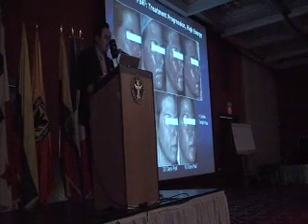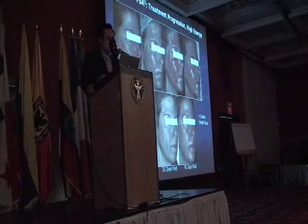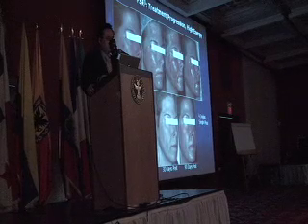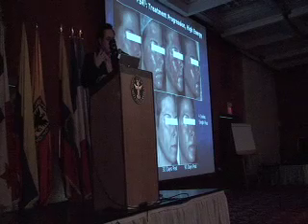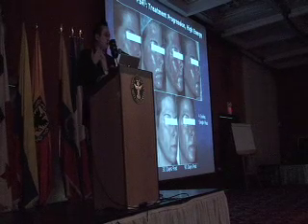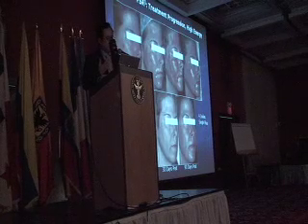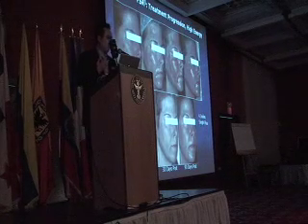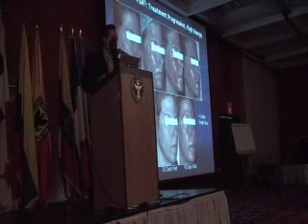These are some examples of a patient that undergoes a high energy setting, and you can see at 4 joules with a double pass, a PSR3, the old skin turning brown and then sloughing away. And you can see that within about a 7-day period, there is a regeneration of skin. I would say that in an older patient, if you're doing PSR3, double passes, in my experience, you could push that recovery toward day 10.